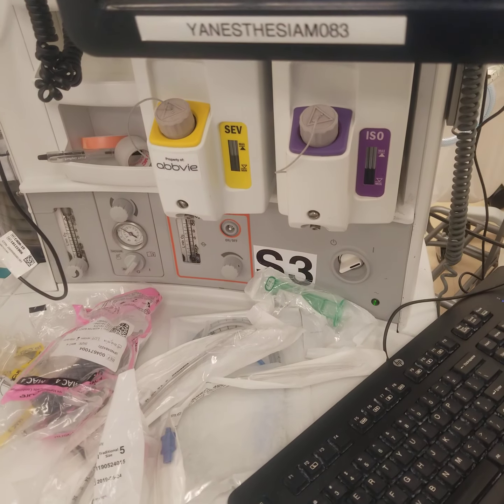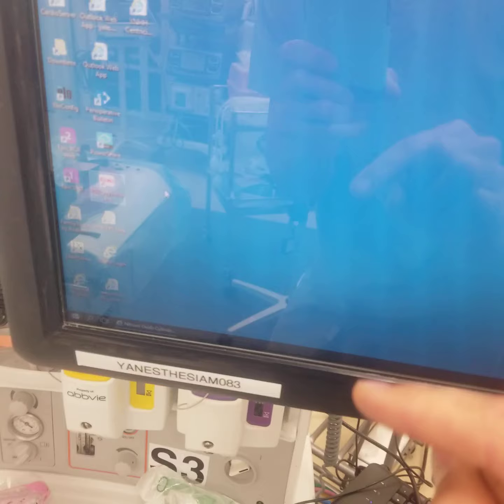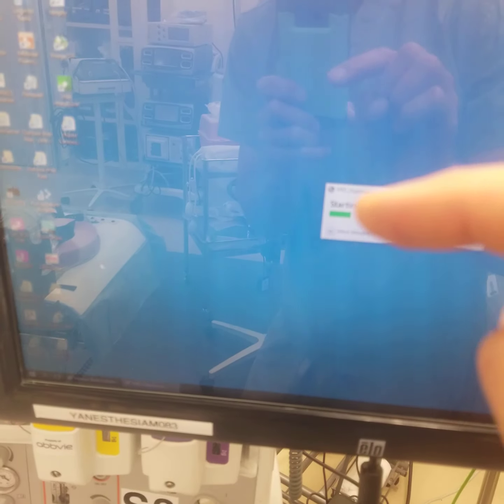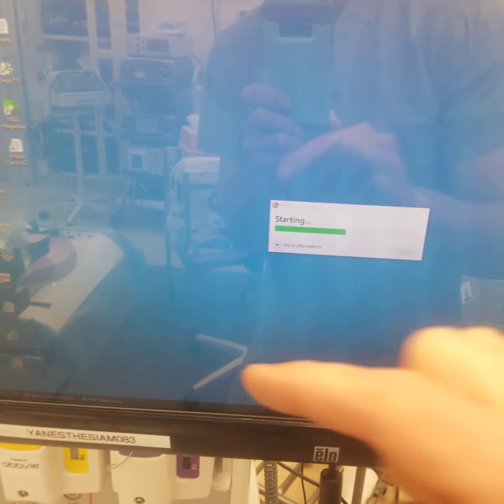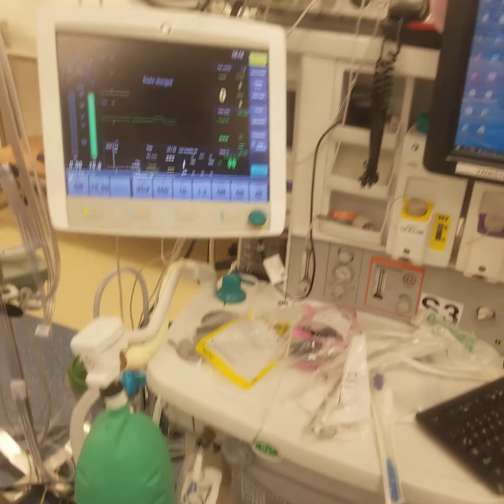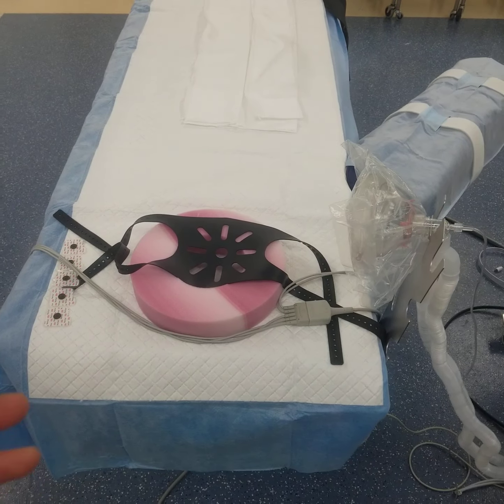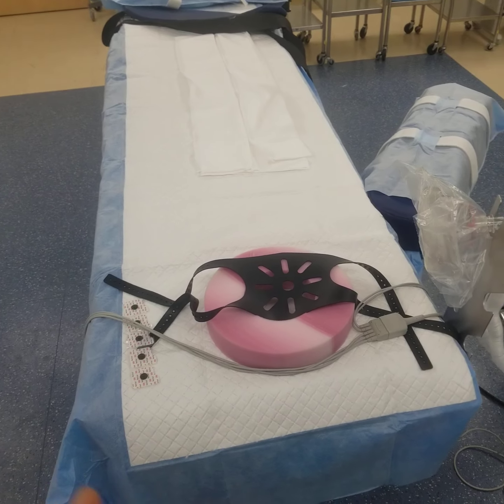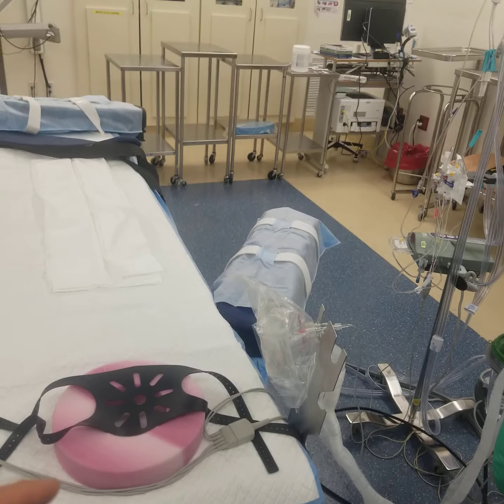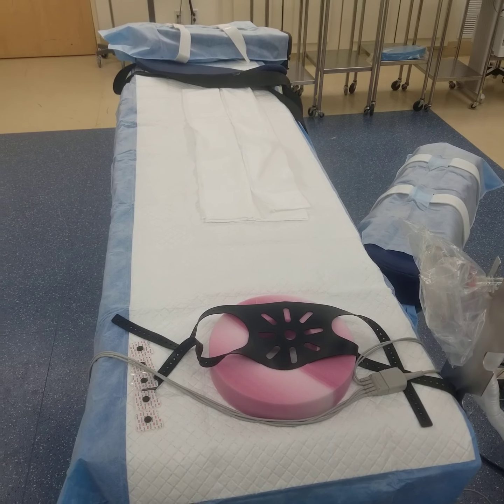Log into your Epic. So I log into Epic. I go to the patient's chart, and I click Start Anesthesia, Start Vital Signs, and in the room. So now it's all going to start recording as soon as we're ready. Patient at this point is now moved over to bed. So you can ask yourself, well, some people are going to be picky and want you to have the vitals on before you give pre-meds. You do whatever you think's best.